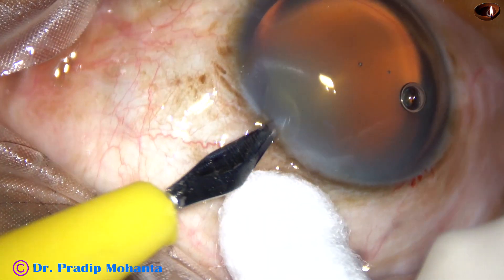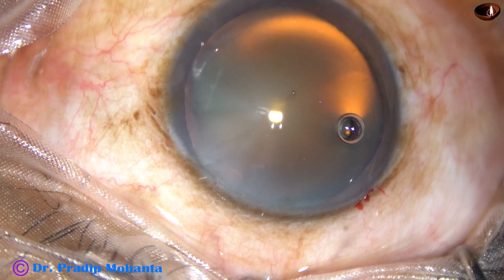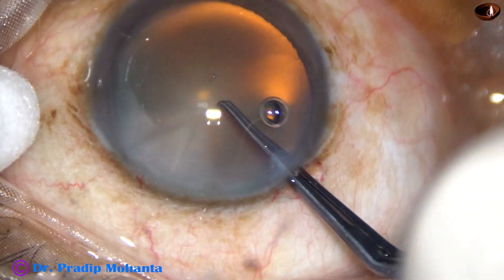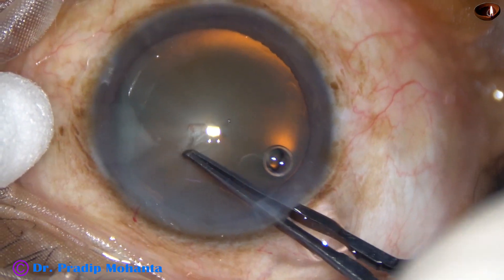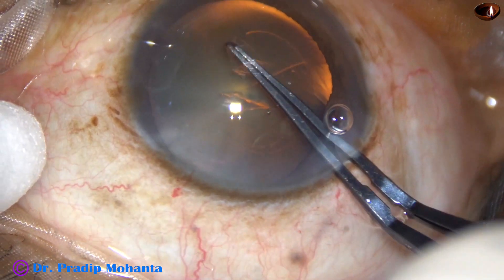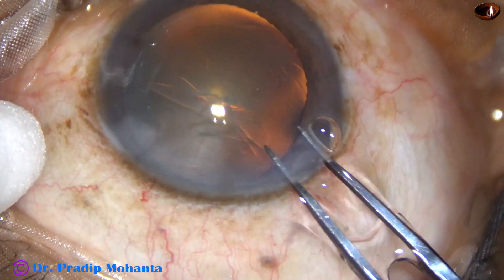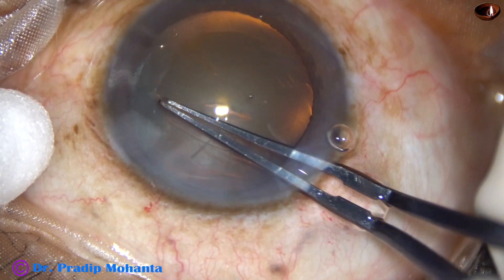This is another case. After injecting viscoelastic in the anterior chamber and applying viscoelastic over the corneal epithelium, the utrata forceps is introduced. The tip pierces the central part, moves to the left, and a capsular tag is raised. The capsular tag is held and by anti-clockwise movement, remaining at a certain distance away from the margin of the dilated pupil, the rhexis is completed.